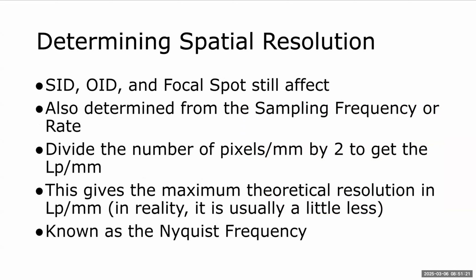So, I already said this. So SID, OID, focal spot still affect spatial resolution. The sampling frequency or sampling rate with CR also affects the spatial resolution.